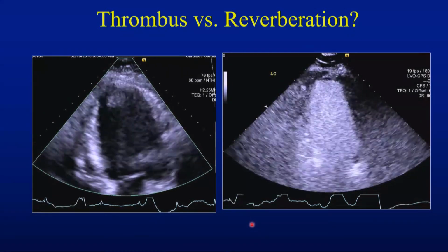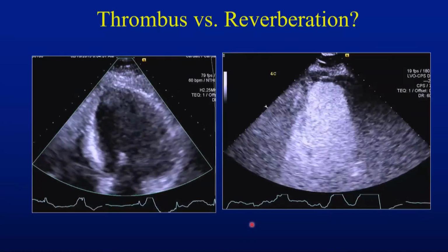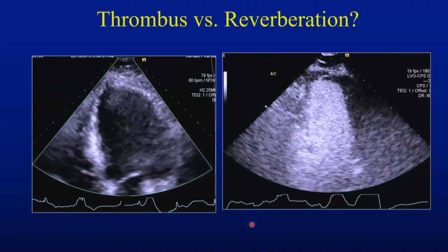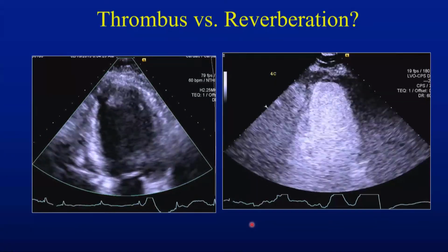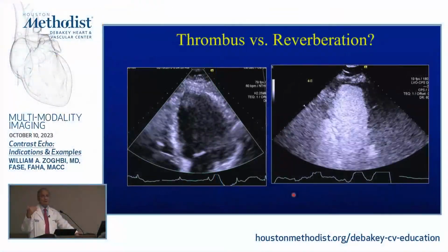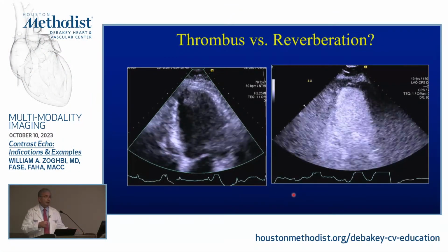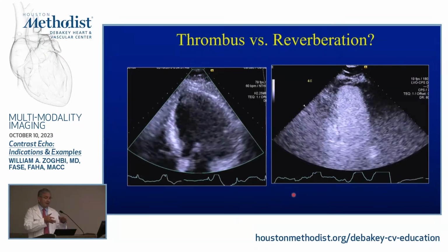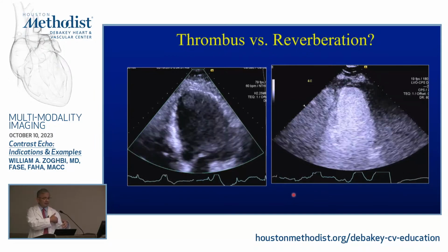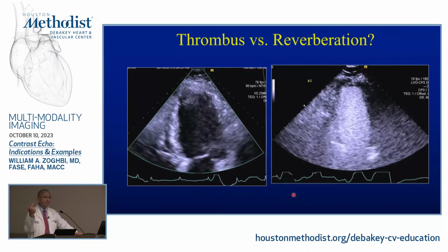Okay, since this is an artifact, you're stranded on an island and you have no contrast, what procedure would you do to minimize this conundrum? Take a different view, right? Go up, down, maybe a short axis, and go down from the parasternal window to the apex. Do the long, off-axis views that you need. That's one. Two.